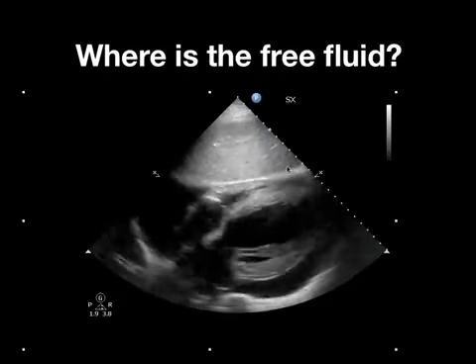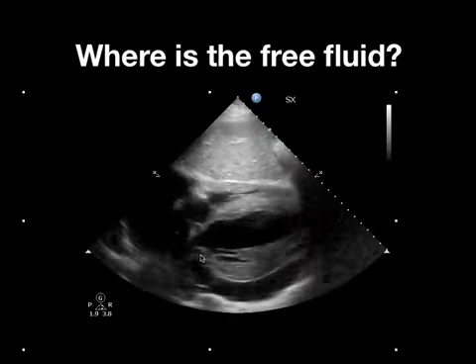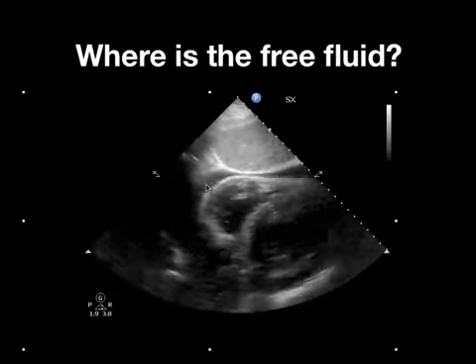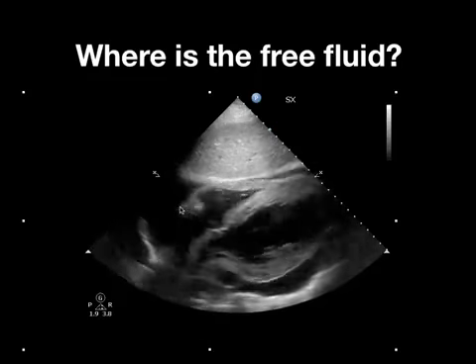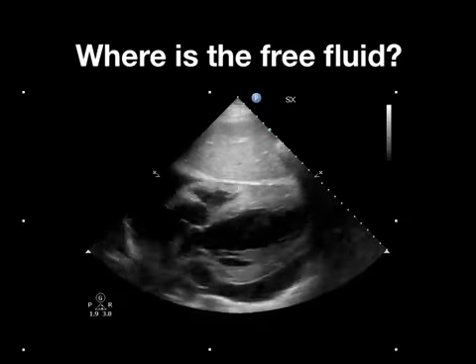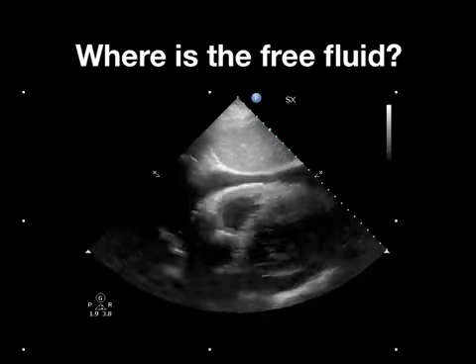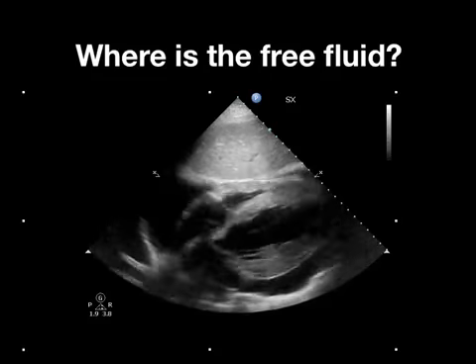So where's the free fluid here? Here you've got the heart, you've got right side here, there's right ventricle, right atrium, left ventricle, and you can see that there's this anechoic space that comes around from the left and goes over towards the right. So based on the shape of this, this is a pericardial effusion. If you were to ever doubt whether or not something was a pericardial effusion, then your best bet at that point is to use additional echocardiographic windows, and we're going to go into those in greater depth during the echocardiography module.